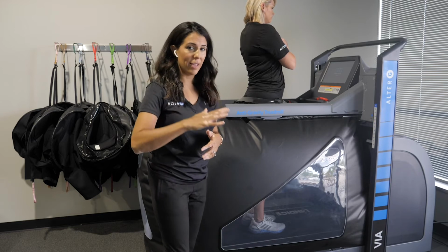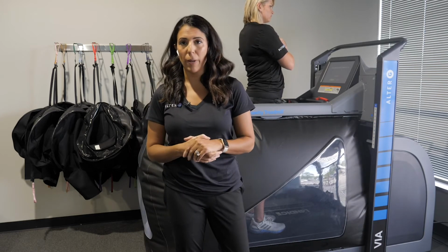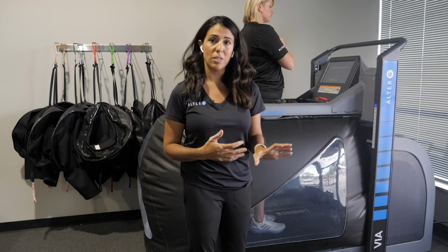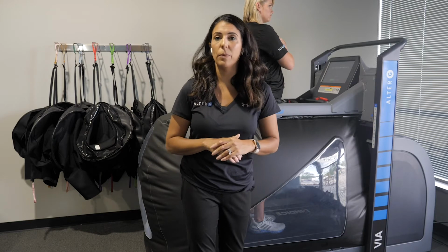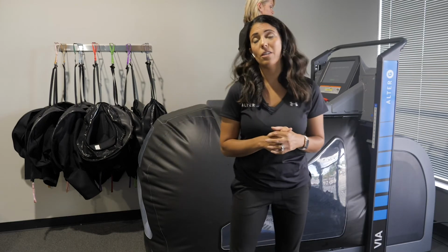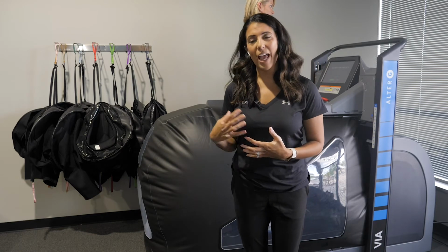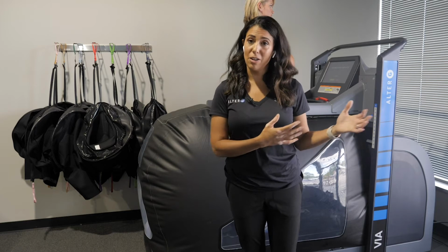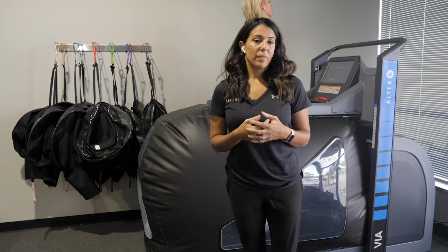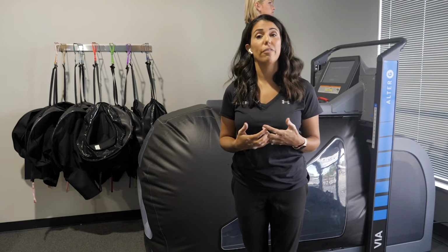Now that you see the bag kind of start to deflate a little bit, it's returning the user back to 100% of their body weight. If you have somebody that is a fall risk, you're going to want to start the session right away and remove enough body weight so that they're in a fall safe environment. That's one of the key features to the AlterG treadmill, is that you can't fall in it. So aside from the precision and accuracy of unweighting, you actually also have a fall safe environment that allows you to practice balance exercises or higher level activities with patients who are at fall risk.